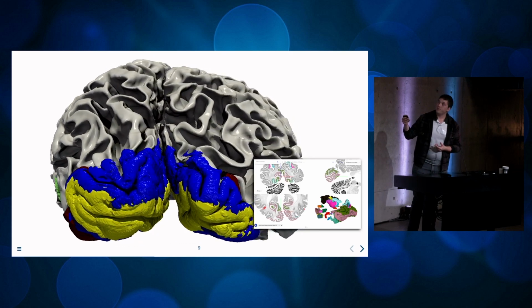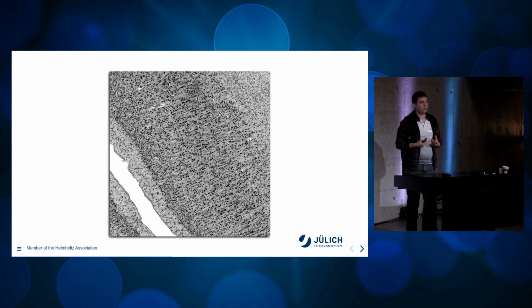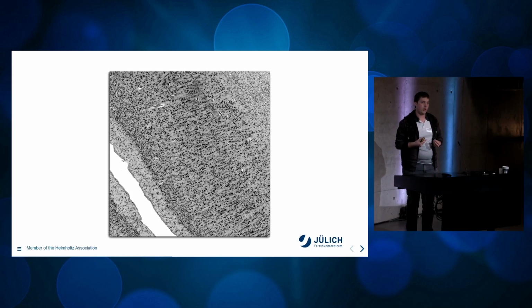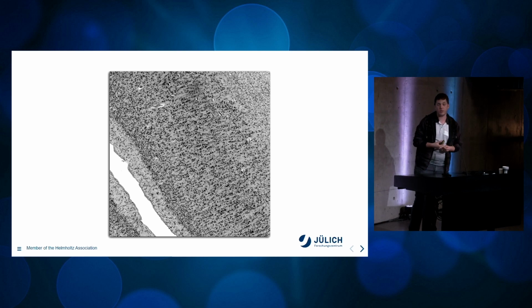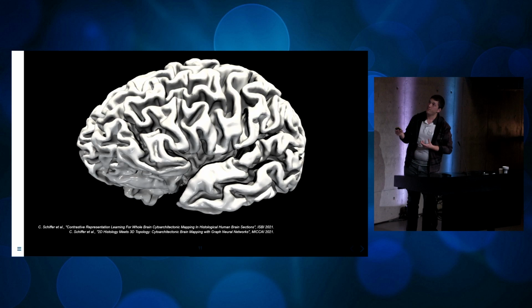Another method we started with going back and thinking about what we are asking our neural networks to do. We give them patches like this and ask them to classify a brain area, which even from an expert perspective is quite unfair, because we have no idea where this patch comes from. This information is just not available to the network, which actually makes it surprising that they work as well as they do.